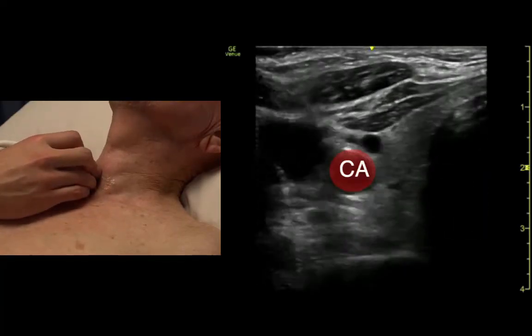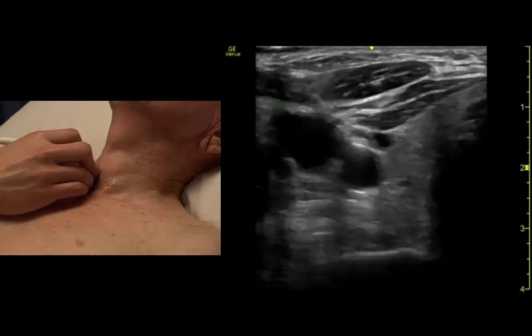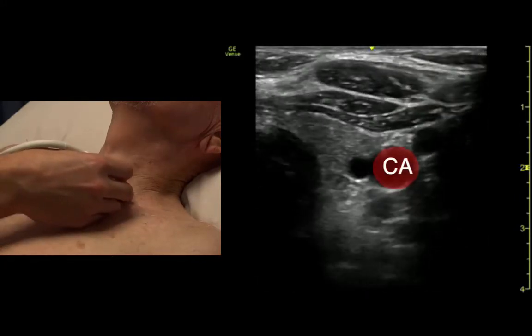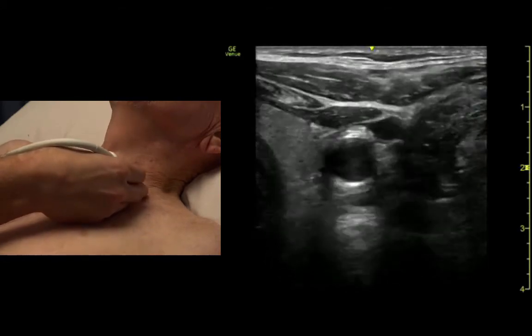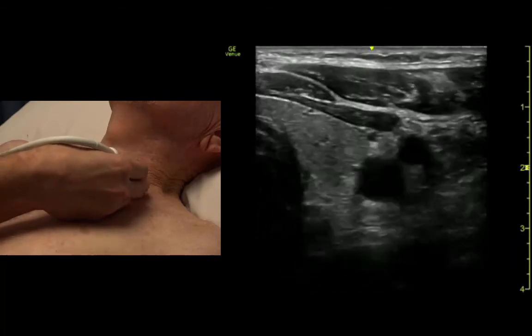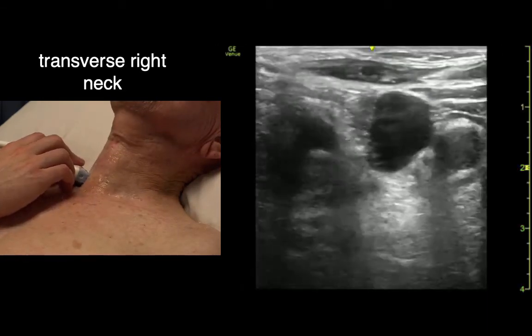We should see the carotid artery and the internal jugular vein there. There's the carotid, and there's the internal jugular. Big breath and bear down — we can make that IJ bigger and chunkier. There's carotid, that's IJ.